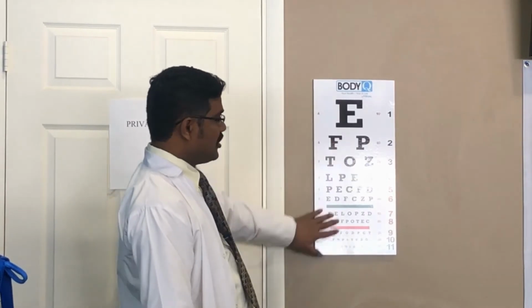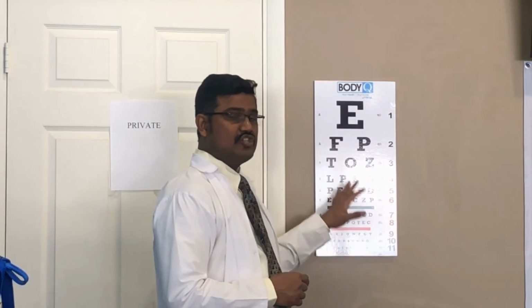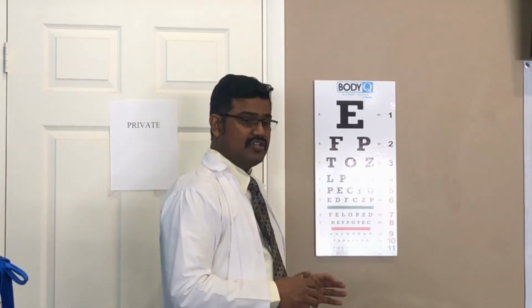In order to do the test, we test in two different variations. One is the static acuity test. The second one is the dynamic acuity test. Before you start the test, this is the eye chart recommended. Keep the patient away from the chart at whatever distance the chart recommends, which is 12 feet away. First test the static and then test the dynamic.